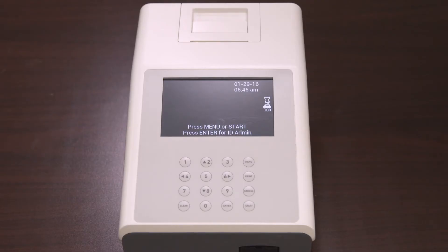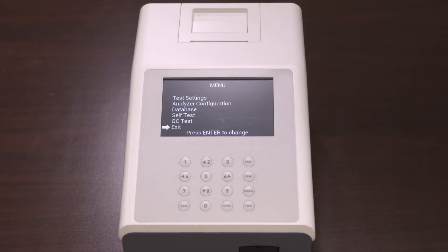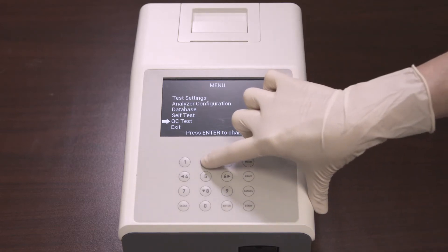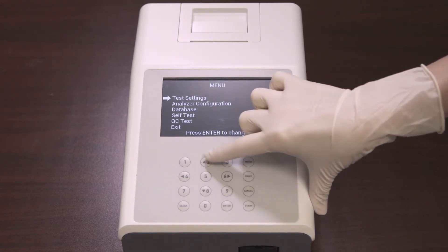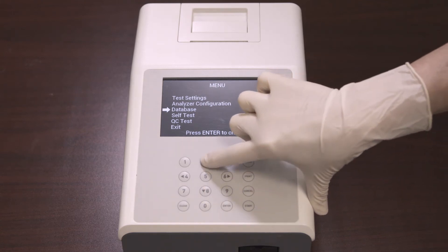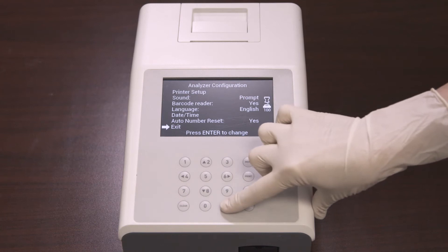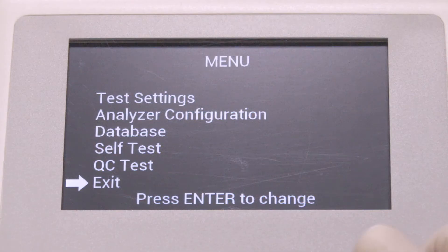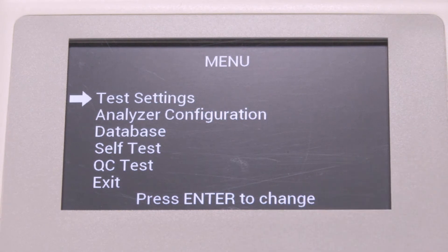Press menu from the initial screen to access the test settings, analyzer configuration, and QC test. Use the up and down arrows on the keyboard to move along the menu. Press enter to select an item on the menu. This is true for all menu screens. Start by selecting the test settings.